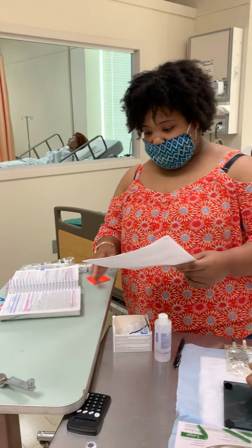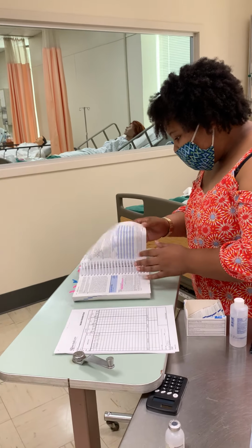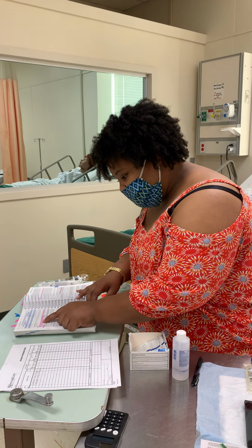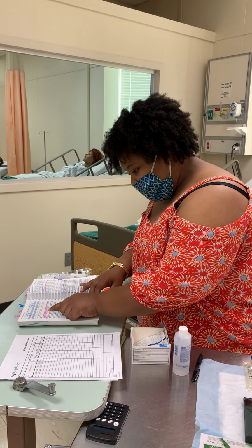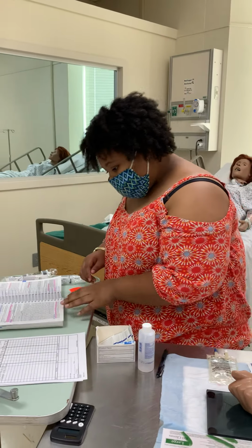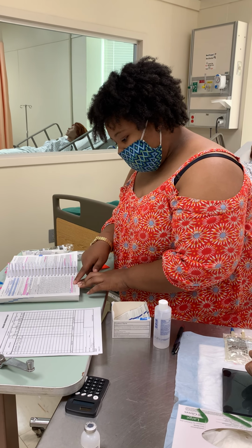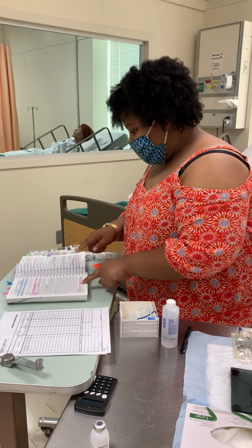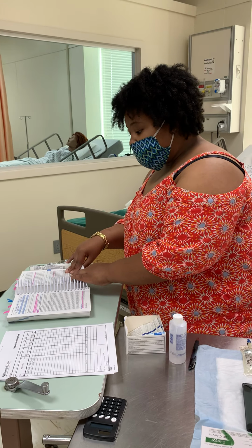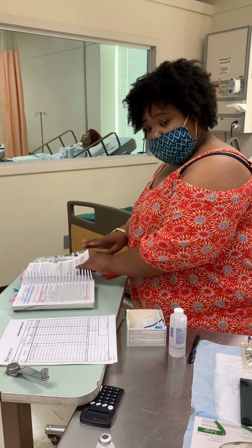And I'm also going to come over here and it says that it can be diluted in normal saline or D5W, and I see that's what I have hanging here. Okay, rate of administration, it says each single dose properly diluted over 30 to 60 minutes, but we're going to do our 60 minutes. And this is used for the treatment of infections of the GI, respiratory, or urinary tracts.